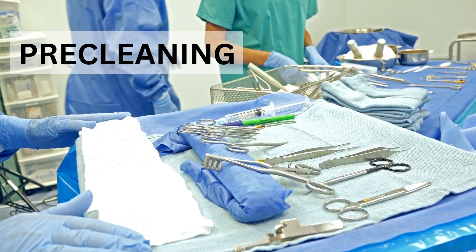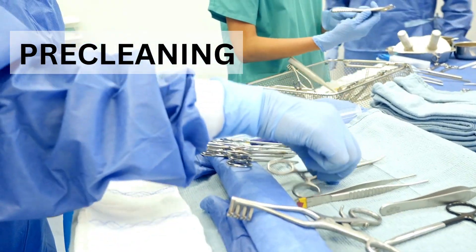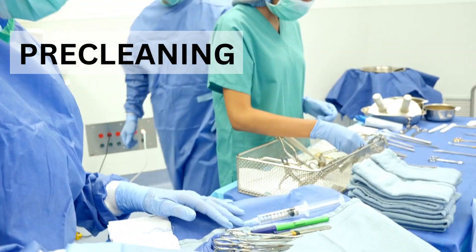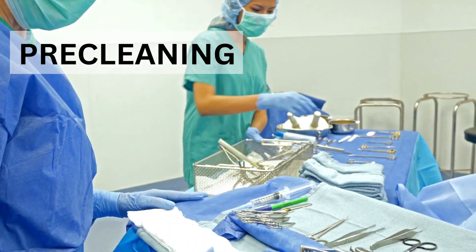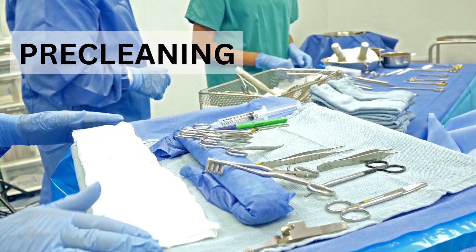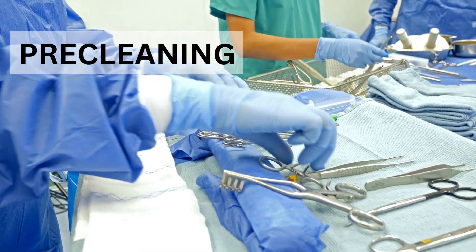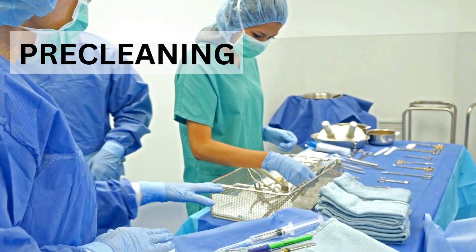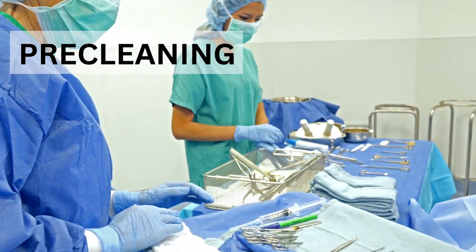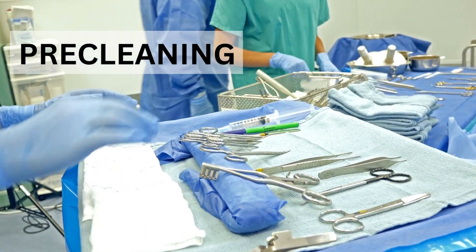Before laparoscopic instruments are taken for disinfection or sterilization, it is important to first pre-clean them. Pre-cleaning means removing all organic debris and organic matter — like blood, mucus, or any other organic component — attached to the surface or the lumen of laparoscopic instruments.